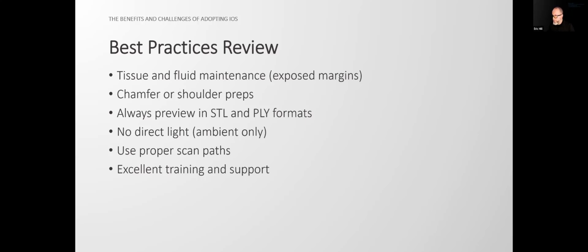Do gold crowns on number 2 or number 15 make it hard to scan the distal for ortho? Yes, but some scanners can overcome that. For example, Medit and Elektra both have a certain lighting format that you can switch back and forth. In Medit, there's a metal icon where you can click that, and it'll allow you to scan those teeth a lot better. On Elektra, you can certainly slide that lighting slider down, and you'll be able to get a little better scans that way.